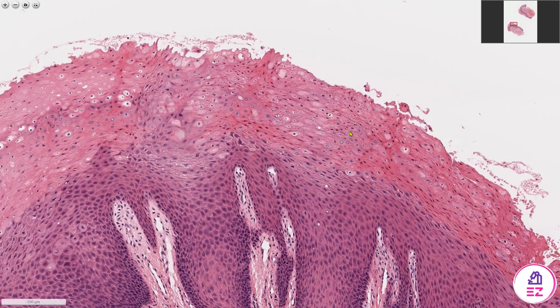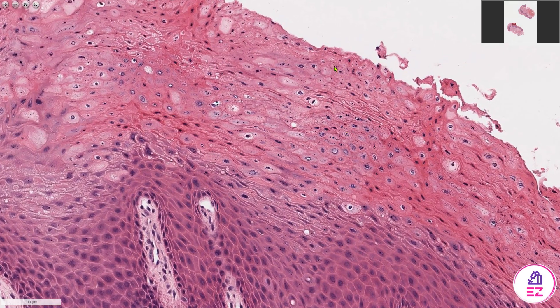When we zoom in, we can see that these keratinised layers contain nuclei. So that tells me that this is parakeratin. If there were no nuclei within the keratin, it would be called orthokeratin.